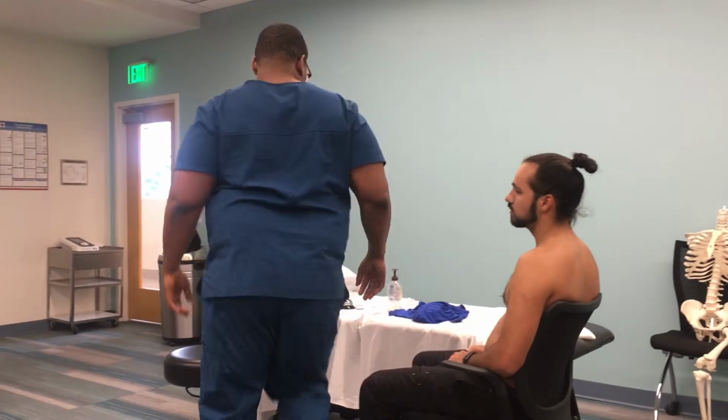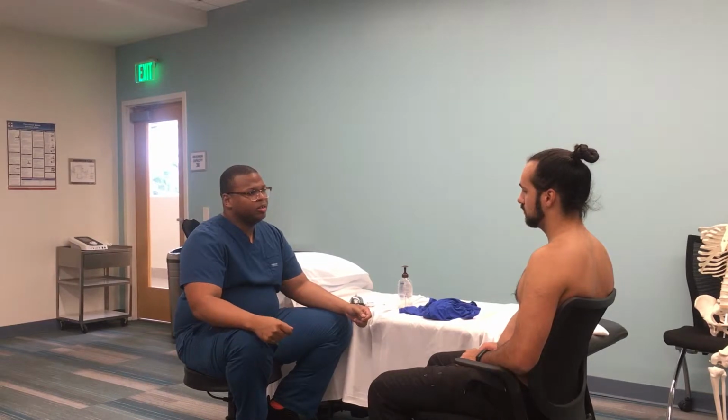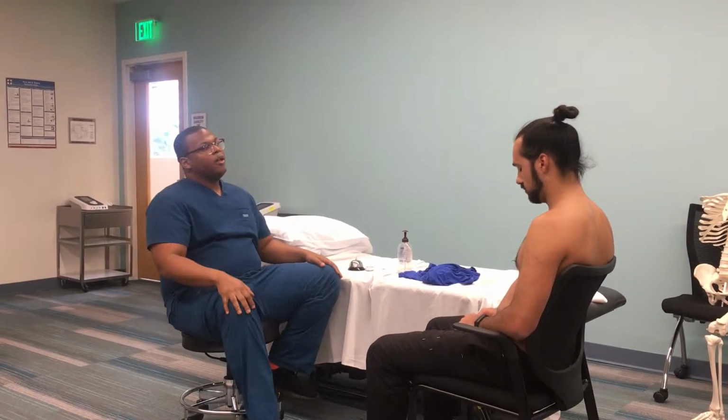Alright, Mr. Machado, before we begin, I just want to talk about some contraindications and some precautions. First thing I want to know is, have you ever had heat therapy applied to you before? No. Okay, do you ever have problems regulating your body temperature? No. Do you have increased sensation to heat? Like, if something hot touches you, do you feel like it affects you way more than it should? No. Okay, do you have a history of peripheral vascular disease? Nope. Have you ever been diagnosed with cancer before? Nope. Deep vein thrombosis? Nope. Okay, that's good to know.